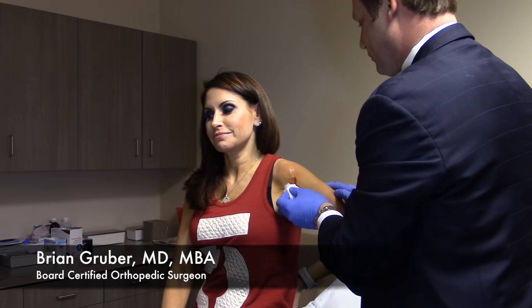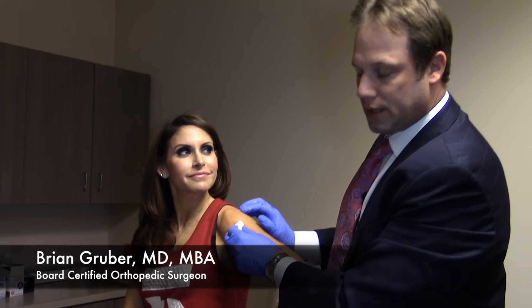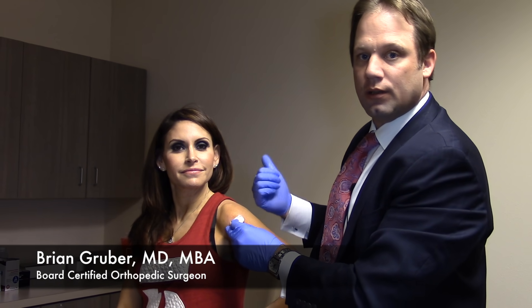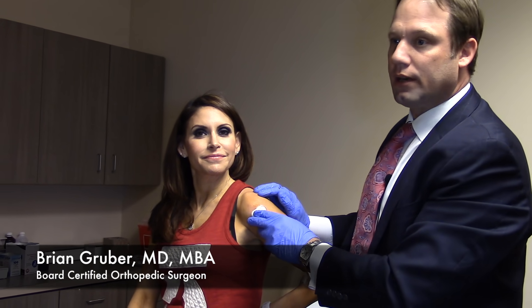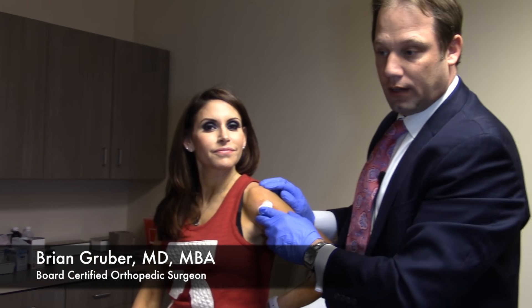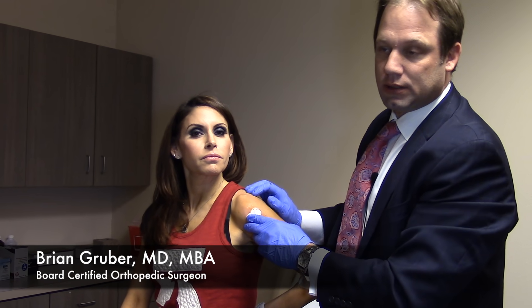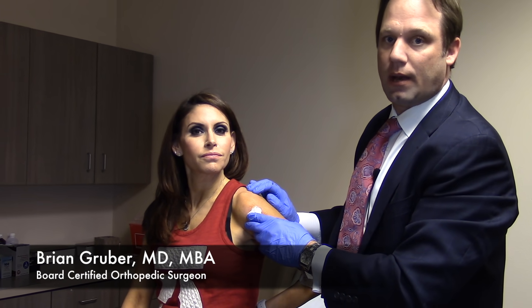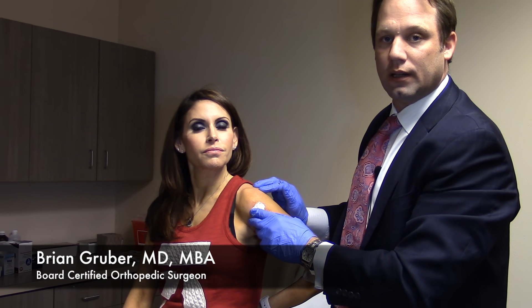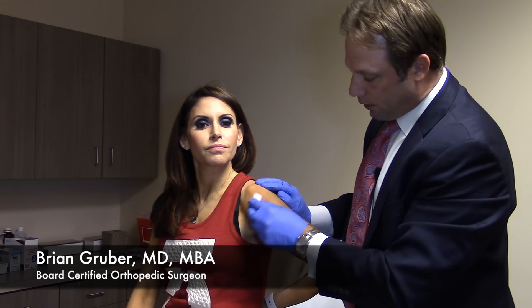Well done, Julie. We put a band-aid on, and after PRP I like patients to ice it tonight. We'll often get patients pain medication for tonight and tomorrow in case it gets sore. The important thing with PRP is you cannot use anti-inflammatories — ibuprofen or naproxen will deactivate the platelets. Tylenol is okay. We like patients to stop NSAIDs beforehand and we'll give them something else for pain, then switch to Tylenol for two weeks. We also typically couple this with physical therapy, usually starting about a week out.